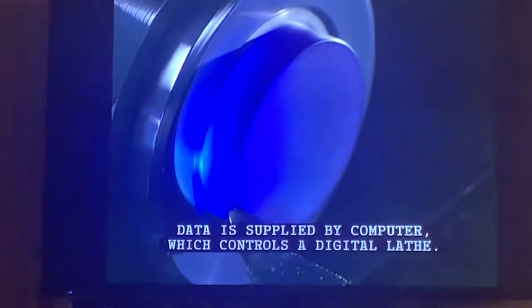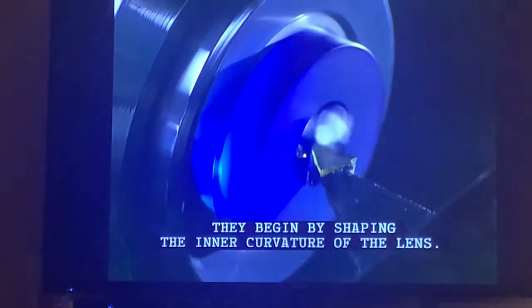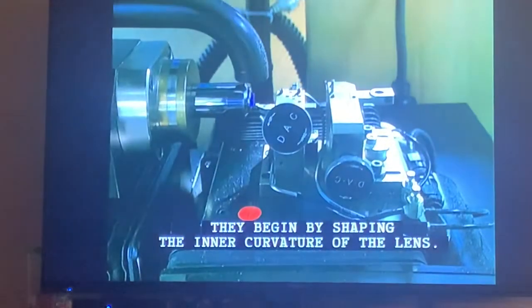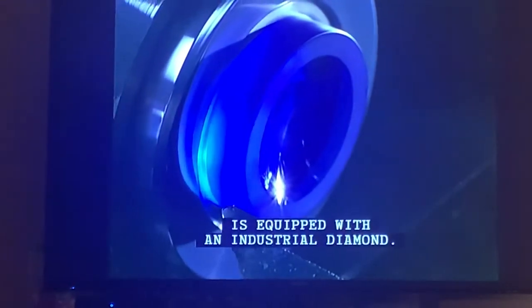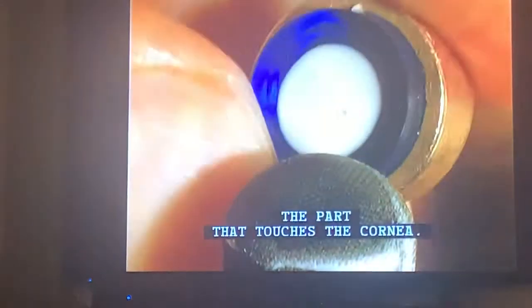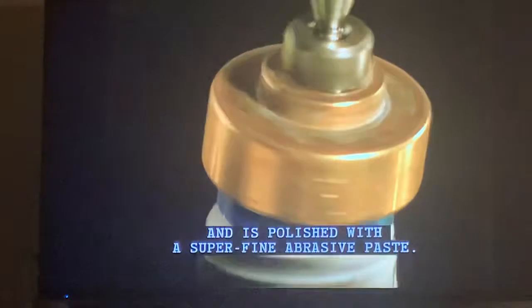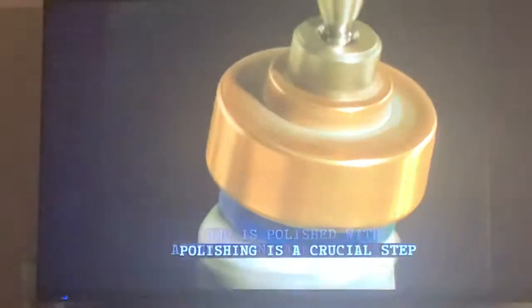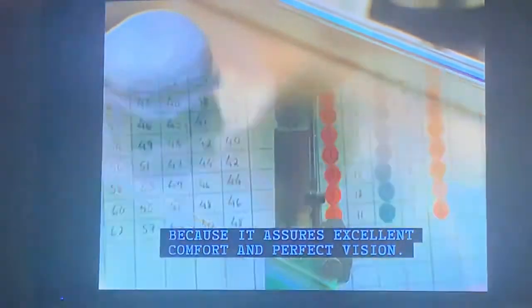Control of the shaping data is supplied by a computer which controls a digital lathe. They begin by shaping the inner curvature of the lens. This digital lathe, rotating at 6,000 revolutions per minute, is equipped with an industrial diamond. It shapes the inner surface — the part that touches the cornea — which must be free from any abrasions and imperfections, and is polished with a superfine abrasive paste. Polishing is a crucial step because it ensures excellent comfort and perfect vision.